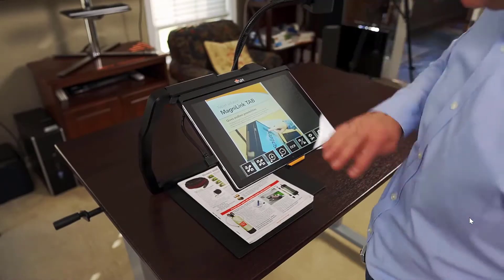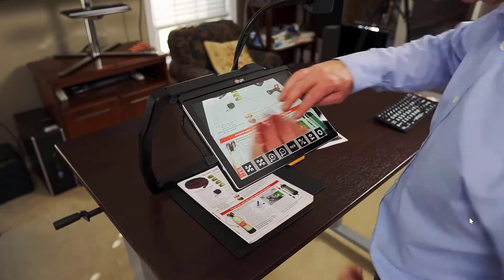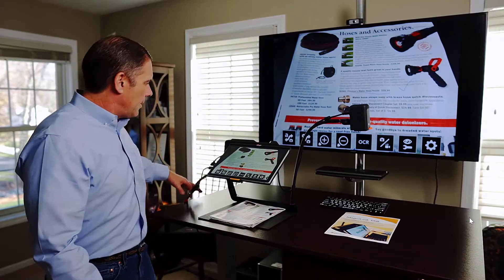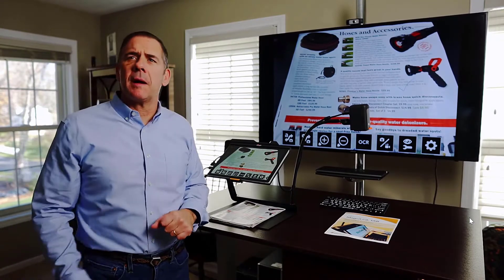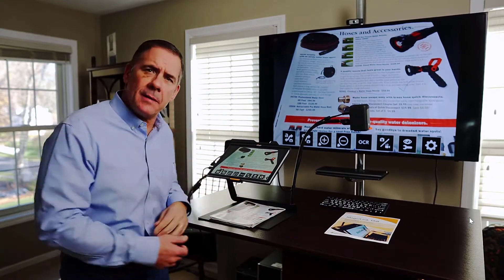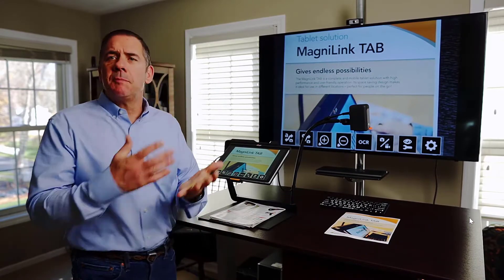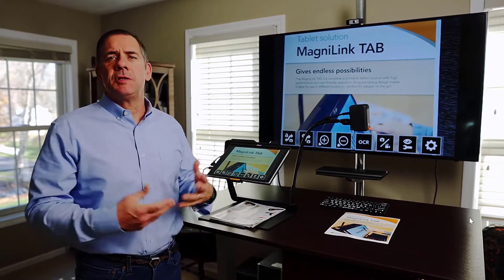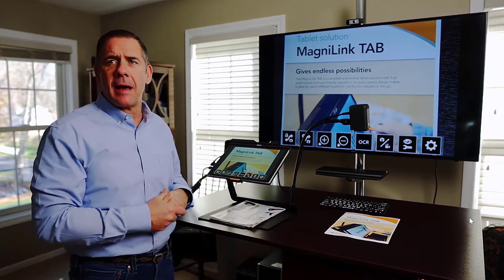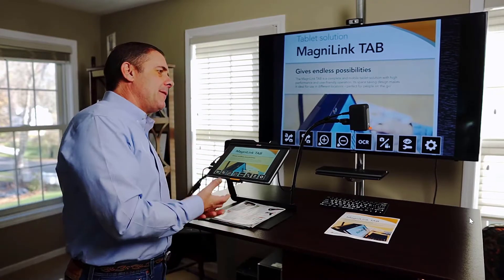Switching cameras is done with four fingers — pull, and each camera switches. As you can see, I have this connected via the display port to a large monitor behind me. Obviously this is the full package, but you have the ability to plug it into any type of screen you'd like. What I want to do with this is magnify, or use OCR — which is text-to-speech — which will take a picture of any printed material and read it back to me.